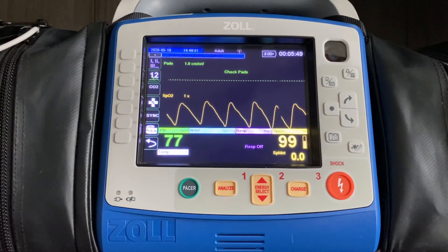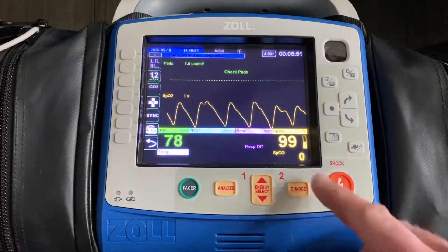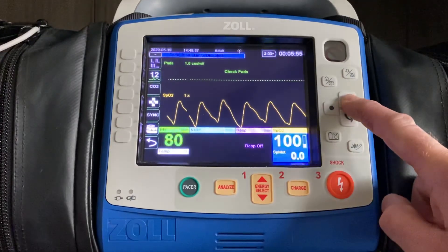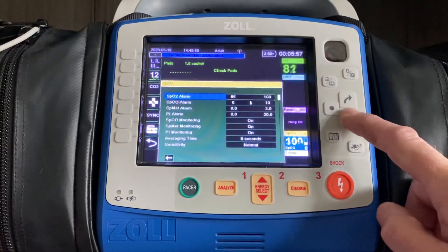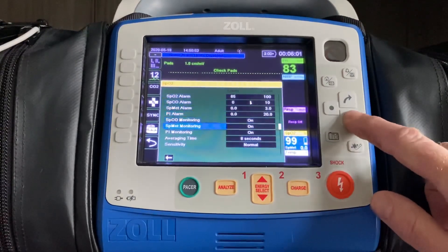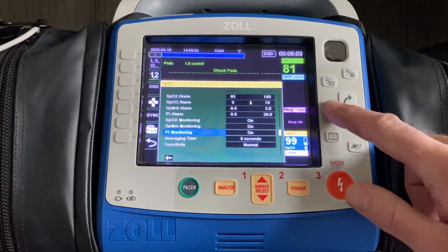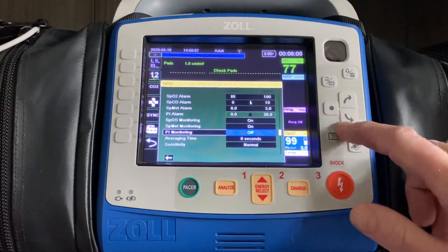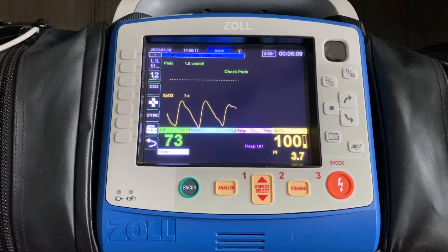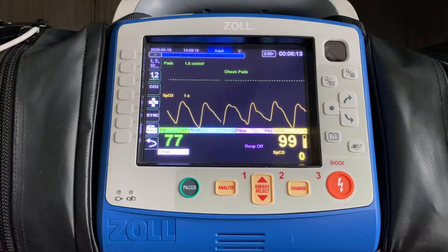This is available on all X-Series. If for some reason you don't see that option in the bottom right corner, you can scroll around, hit enter, and where it says PI monitoring, you can make sure it says on. If it does not, you can toggle over, switch it to on, and then hit the home button. Going forward when you're treating your patients, you'll have the perfusion index as an option for a vital sign monitor.